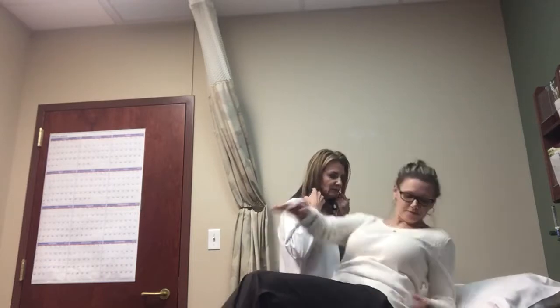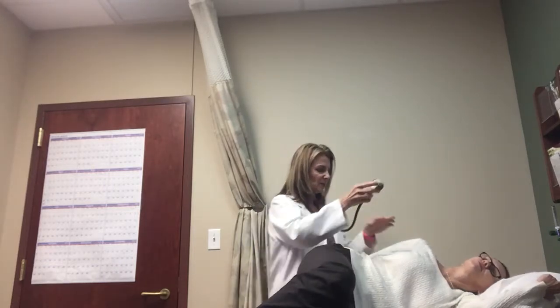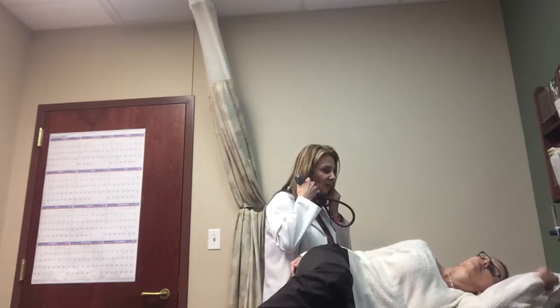And if I could just have you roll over on your left side, please. And this time I'm going to listen with the bell of my stethoscope. All in the same places. Okay, good. So you can sit up.